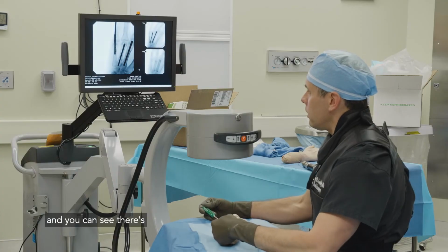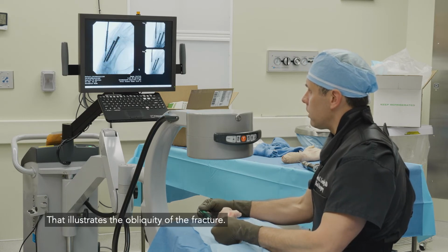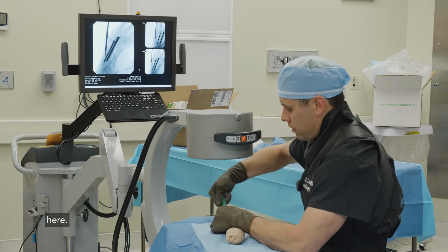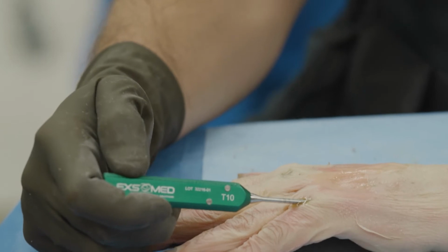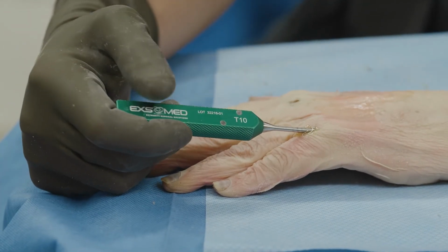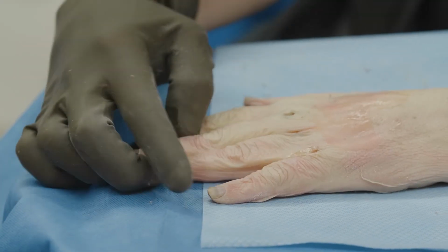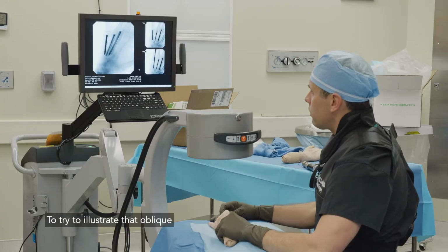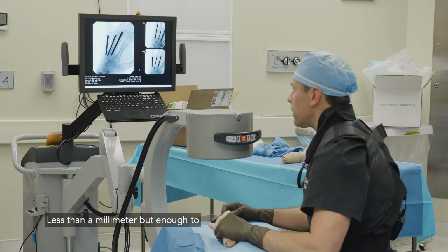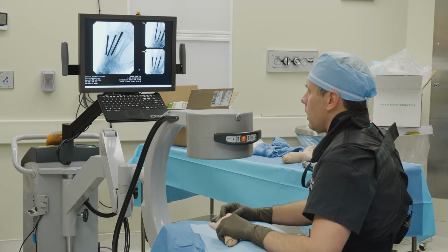And you can see there's really no shortening at all so far. That illustrates the obliquity of the fracture. Getting some good cortical purchase here. To try to illustrate that oblique fracture again, you can still see a little bit of a gap, less than a millimeter, but enough to know that I have not shortened the bone, which is my goal in this case.